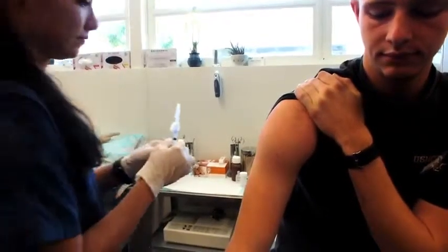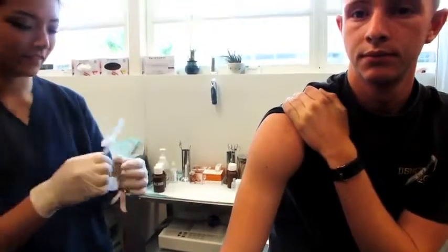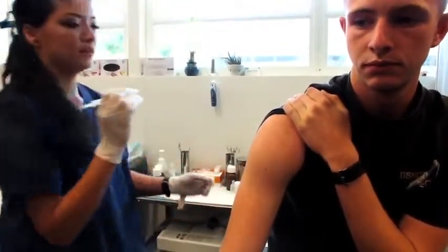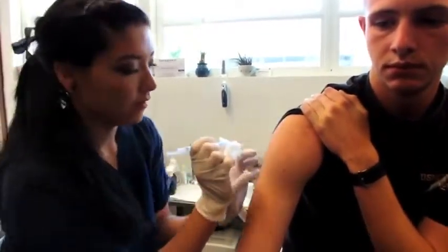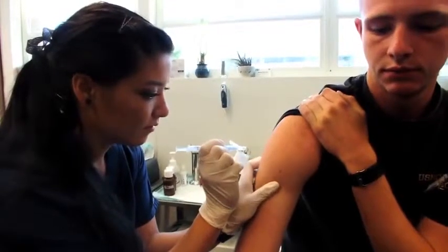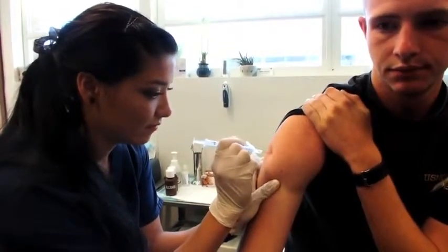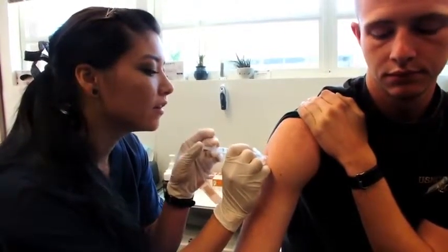Okay. So, make sure I have my sharps container at the ready. Okay. It's going to go intramuscularly with 3 fingers. Okay. You're going to feel a slight poke. Aspirate. Then inject.